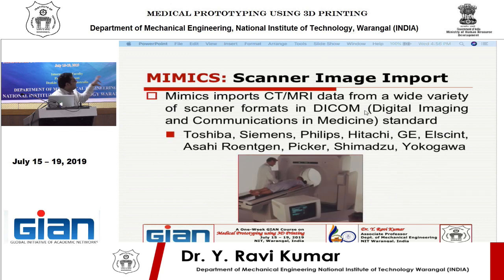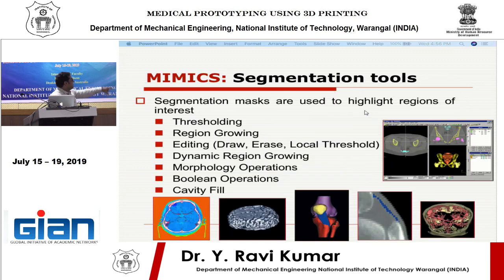So anyway, you have the import module. As I said, it should be a DICOM image. All these machines have a version of DICOM or NEMA. Earlier there was one NEMA standard, but now it's DICOM. So every new machine has DICOM compatibility. You just save your images in a DICOM format, and then the basic tools. I think you are going to explain some of the tools, but it is not possible to explain all of them. Maybe we have to have one separate workshop for that.